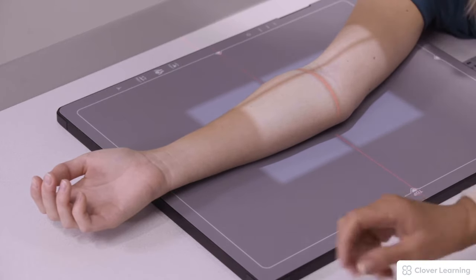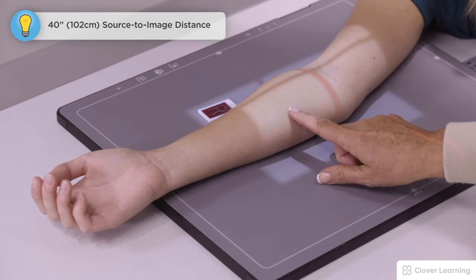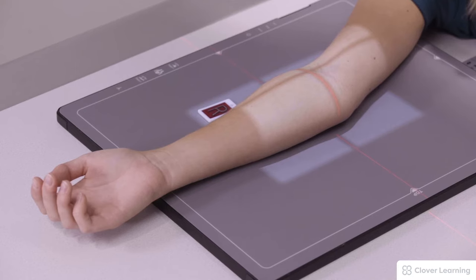We want to place our marker, and here you will see the distal humerus, the elbow joint, and the proximal radius and ulna. The patient will hold very still, and then the exposure is taken.